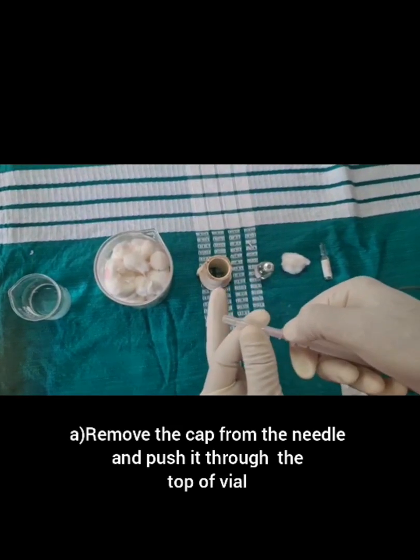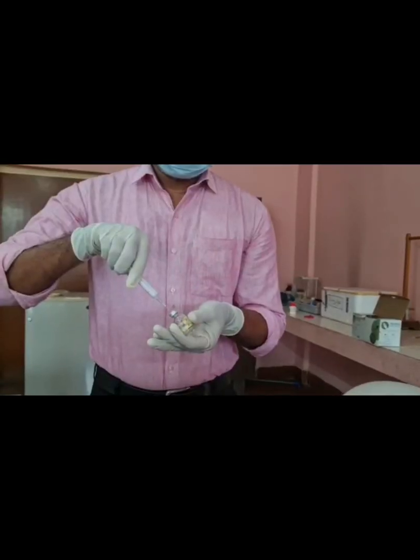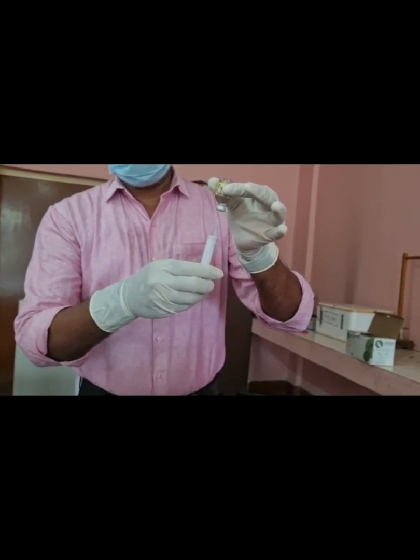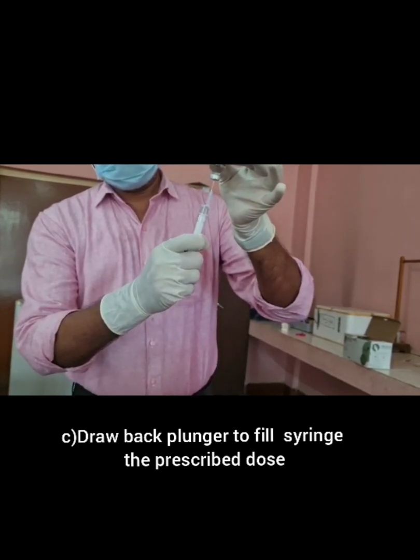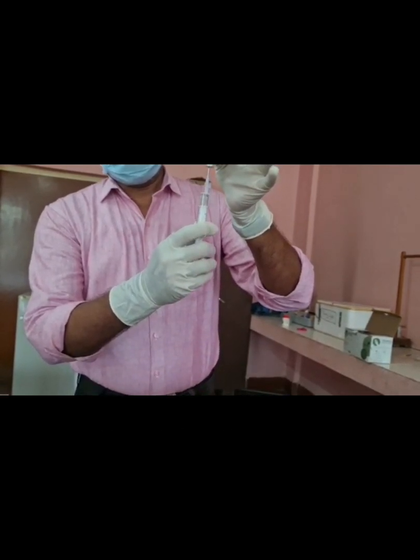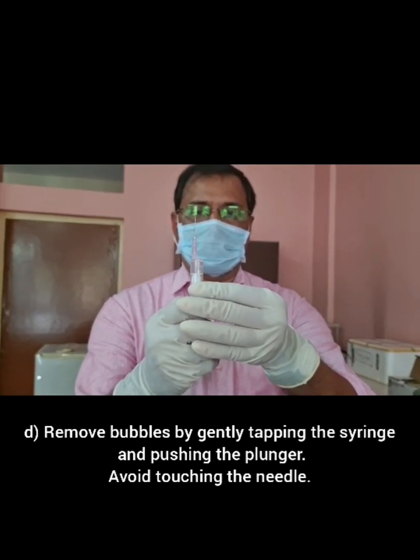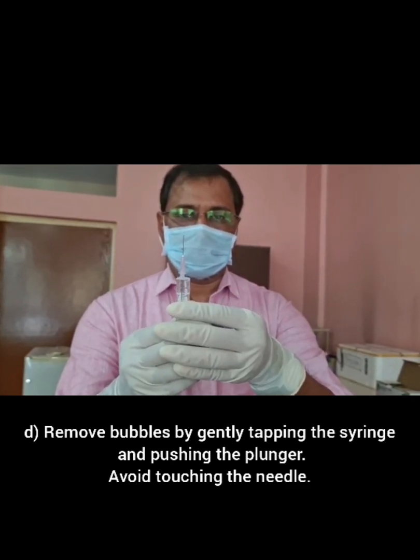Remove the cap from the needle and push it through the top of the vial. Turn the vial and syringe upside down so that the needle points upwards. Draw back the plunger to fill the syringe with the prescribed dose of the drug. Remove the bubbles by gently tapping the syringe and pressing the plunger. Avoid touching the needle to ensure it stays clean.